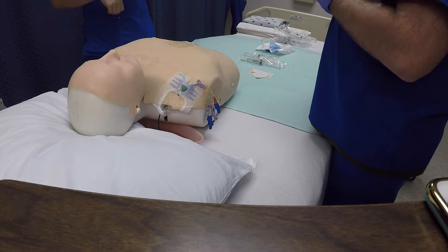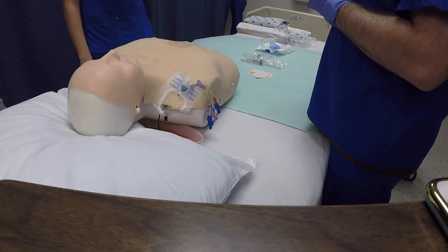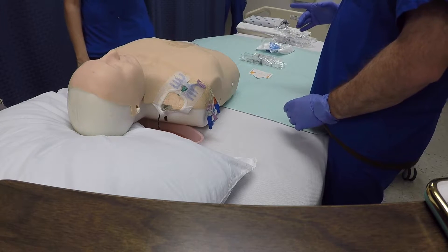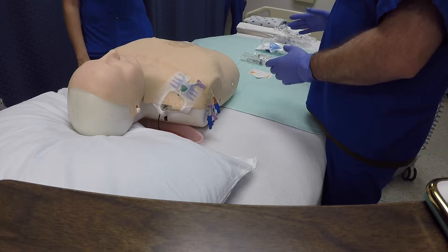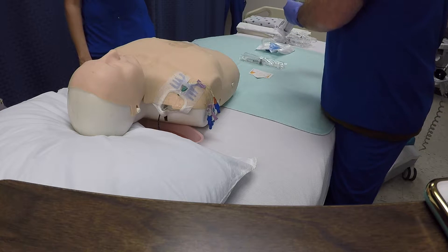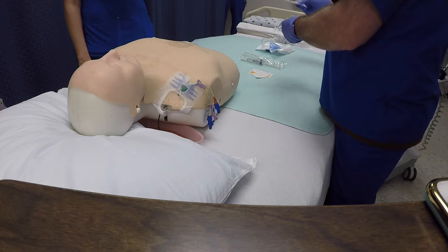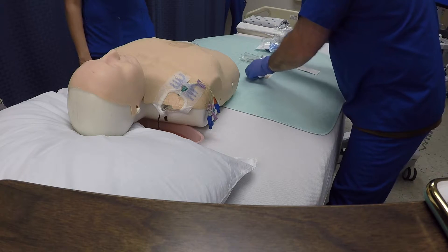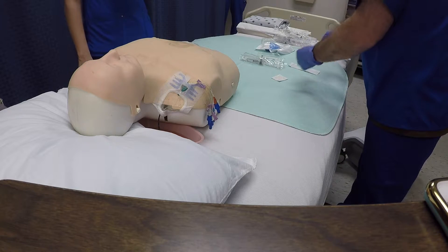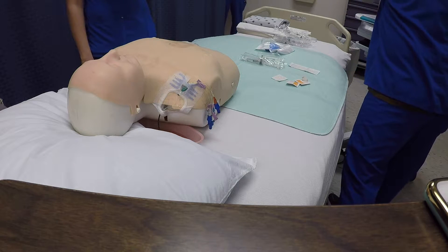There were six important steps. Step number one is prep the supplies — got them here. Key point number one is to keep the connection sterile, and that's to avoid contamination. Key point number two is one alcohol pad per bottle for ten seconds, and that's to disinfect.